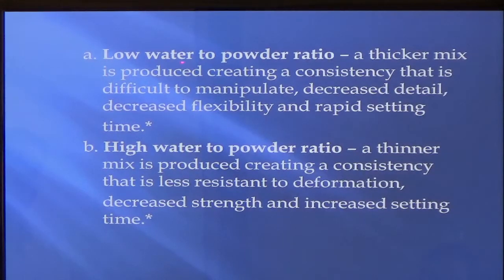Okay, low water to powder. So low water, more powder. That's going to give you a thick material. Okay, so low water, these you need to know, because there's a few questions on the exam. So low water to powder means you're going to have a thicker material. Okay.